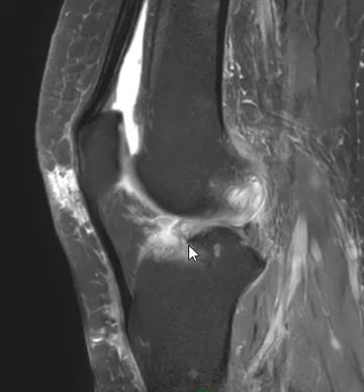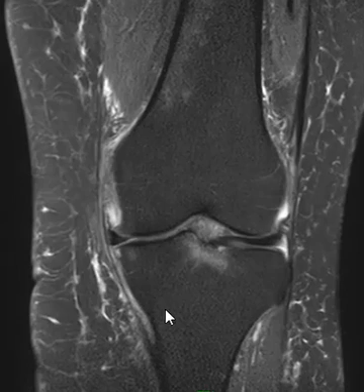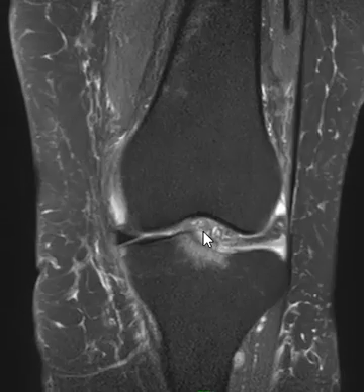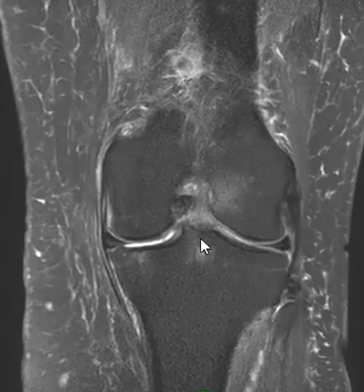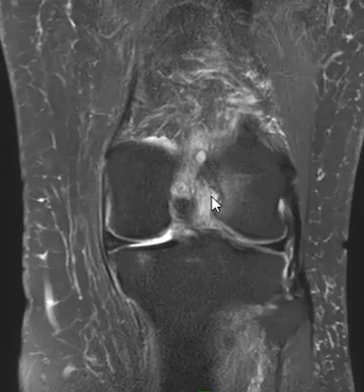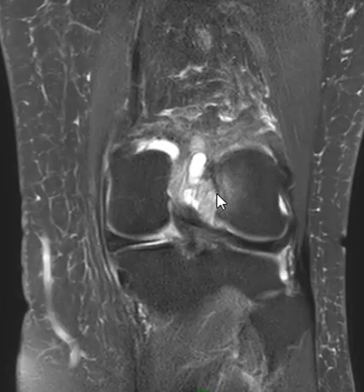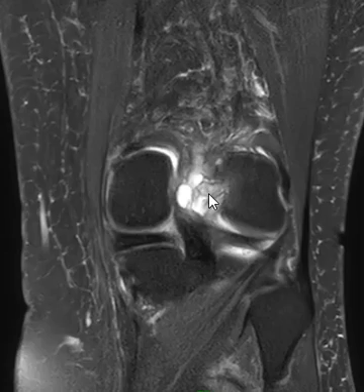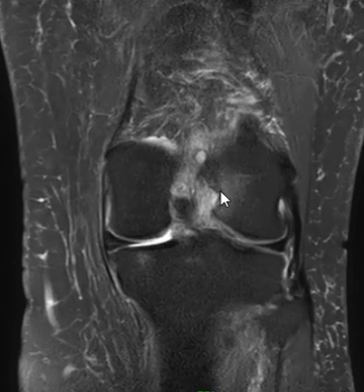Also the intercondylar notch right over here had some reactive marrow edema. On coronal images, we can see that edema here. You can see how broad the ACL is at the tibial attachment. You can see that bright signal, and those longitudinal fibers still intact. And here you can see some scalloping of the femoral condyle, a little bit of reactive marrow edema, and here's that cystic component along the back. So this is an expanded ACL cyst.